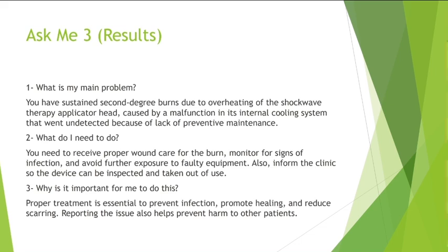First, what is my main problem? The patient developed a second degree burn after a session of shockwave therapy. The device used had an overheated applicator head, which burned the patient's skin. The root cause was a malfunction in the internal cooling system, which failed to regulate the device temperature. Unfortunately, the device had not undergone preventive maintenance, and the malfunction went unnoticed.